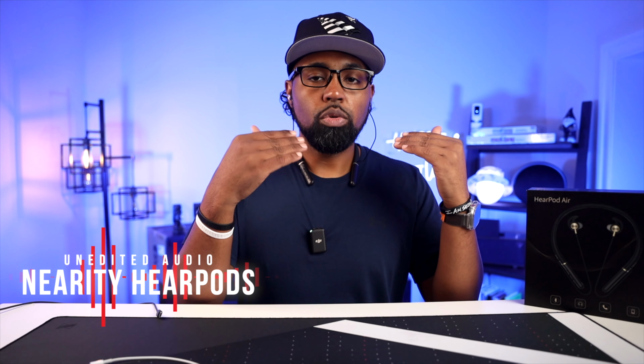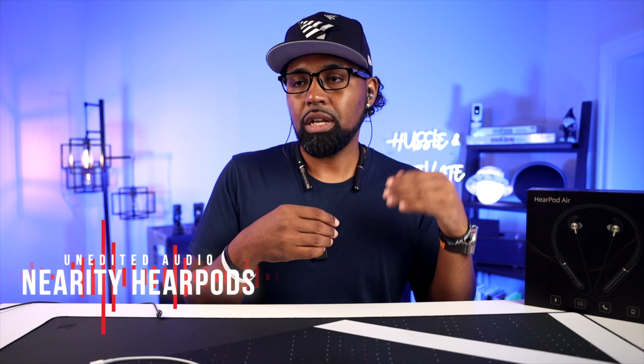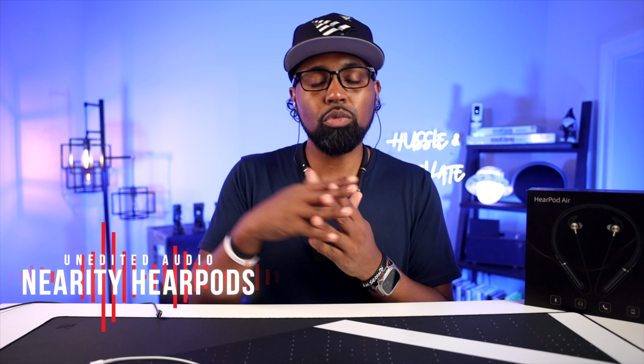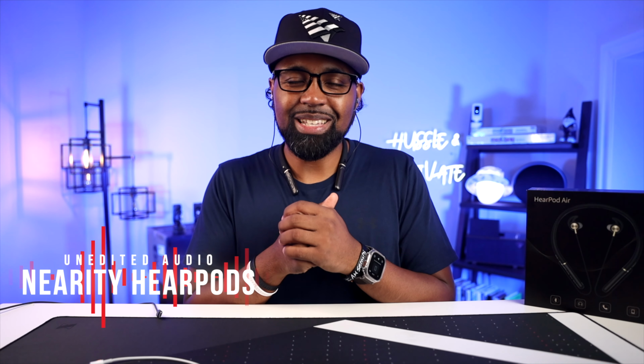But like I said earlier, you're able to amplify sound with these. You're also able to listen to music with these, and you're also able to take calls with these. So as you're hearing my voice right now, this is exactly how you will hear the other person, or the other person will hear you on the other end of a phone call. But when you do that, you do lose all connection with being able to amplify the sound, and also your different sound modes that these are capable of. So once you get off a phone call, it gets you out of that Bluetooth mode and gets you back to the hearing mode, and everything goes back to normal. I wish I could show you the test that I had set up in my brain, but it just didn't work out that way. So I apologize about that.